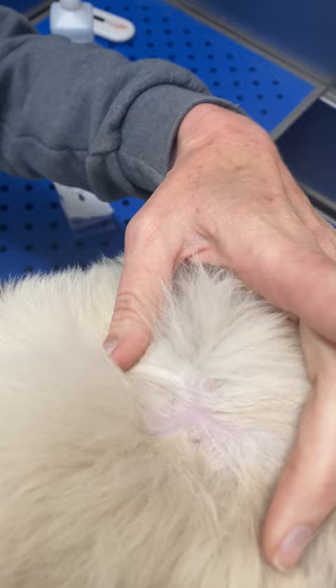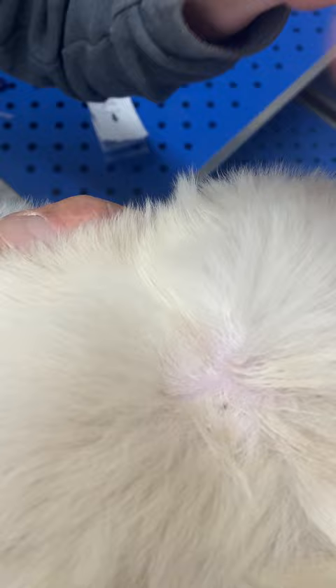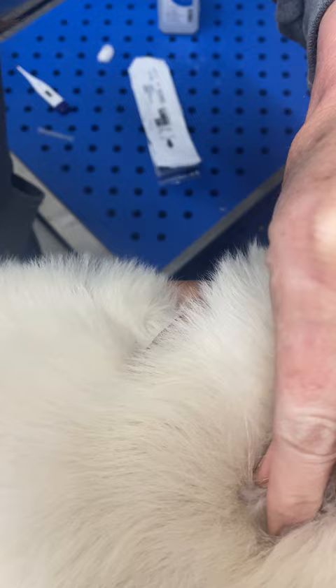The needle is pre-loaded with the microchip already in it, and it is a huge needle. So you're going to put the beveled edge against the puppy. Make sure that's dry, then you're going to tent that skin. You're going to put that needle all the way in and push it in, and then I'm going to pinch that closed — pinch the little hole closed.